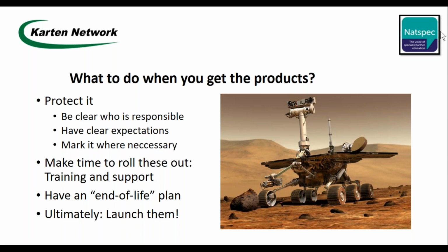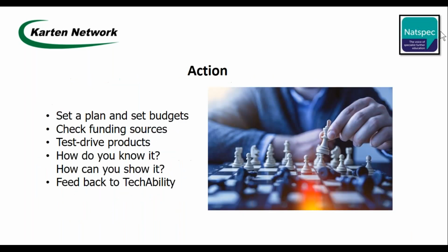So some things will just go forever until they break. So things like switches, other things like tablets, particularly iPads, you need to be thinking about, okay, when do we need to update these and when does that need to come in? And ultimately, the most important thing is to launch them, is to get them out there, make sure that they're being used with, as we said earlier, that outcome drive. So you're actually deciding that we're going to use these products in a meaningful way for our students or users.